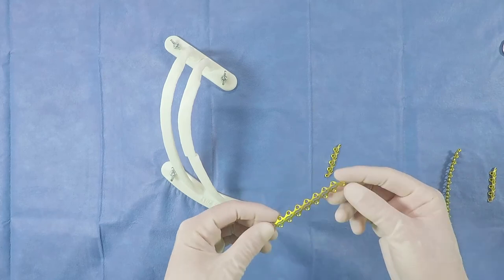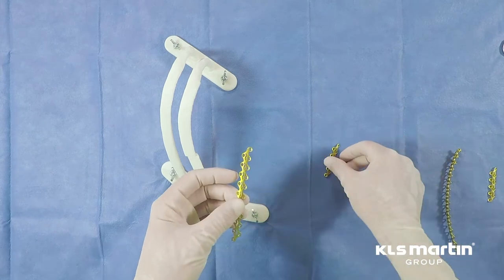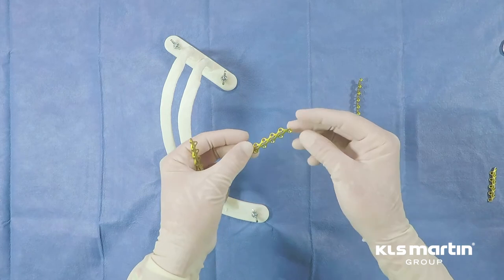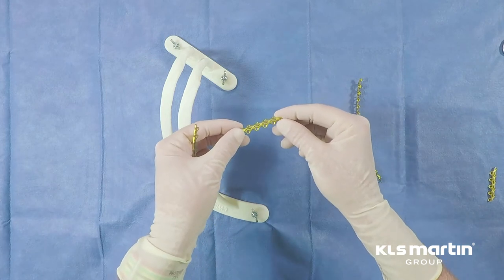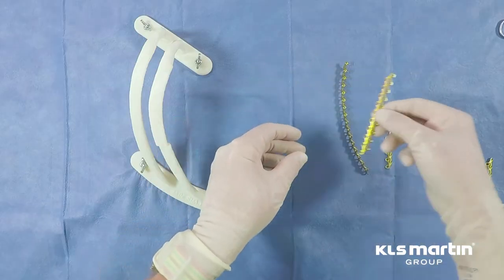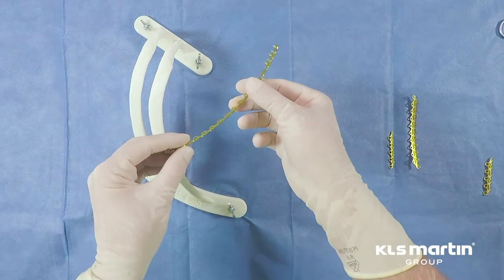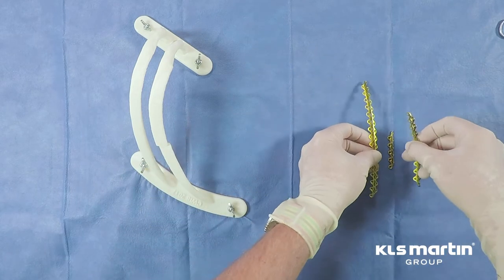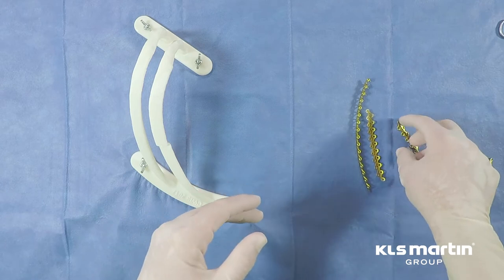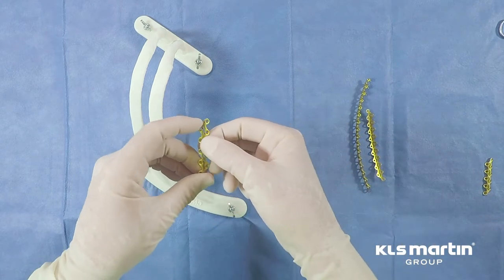We're here to demonstrate the KLS Martin L1 rib plating system. There are three plate options. The most commonly used plate is this 10-hole construct. There is a longer 20-hole variety and an extra-long 32-hole plate. Plates are designed to be shapeable to adapt to any rib contour, and with only three choices, it certainly simplifies the procedure.